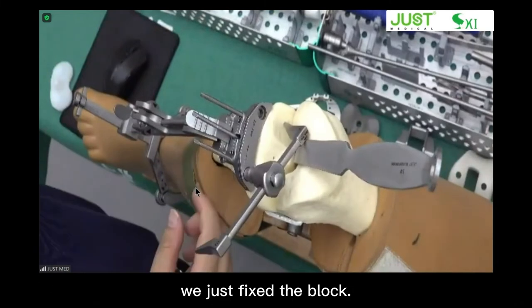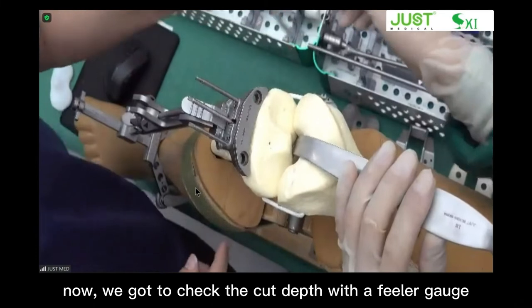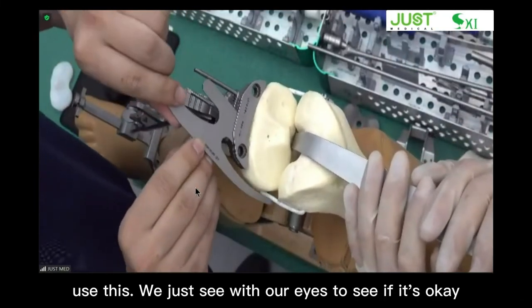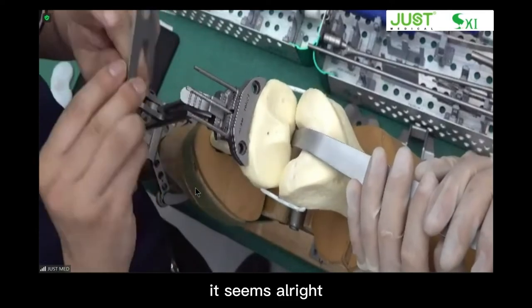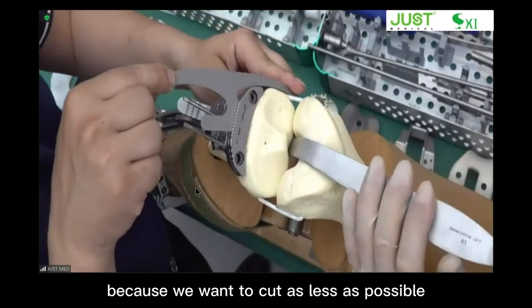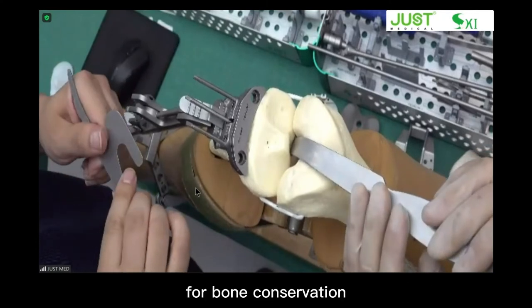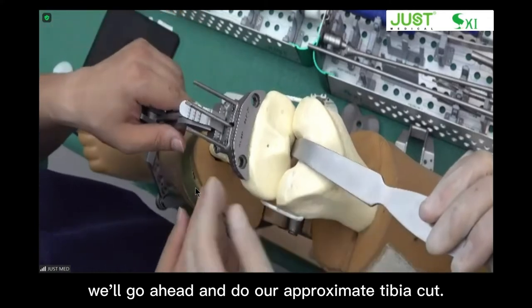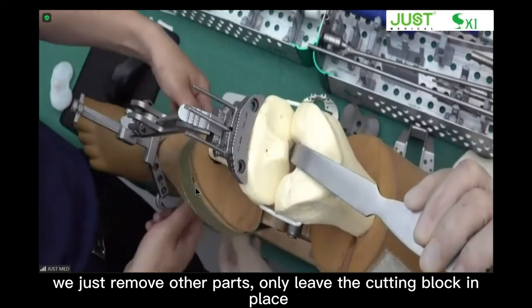Yeah, we just fix the block. Now we gotta check the cut depth with the feeler gauge. We just see with our eyes to see if it's okay. It seems all right, because we want to cut as little as possible. Bone conservation. If everything's all right, we'll go ahead and do our proximal tibial cut. We just remove other parts, only leave the cutting block in place.